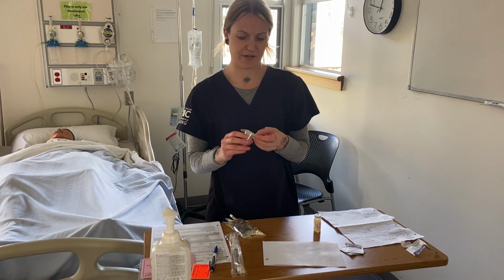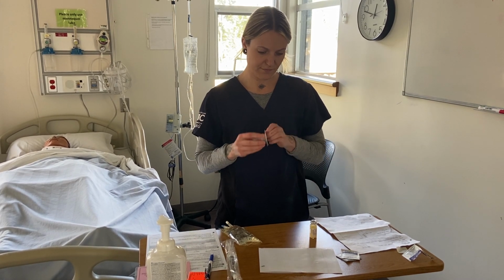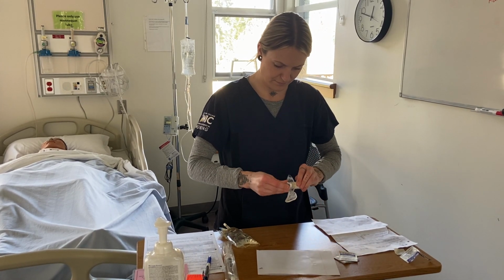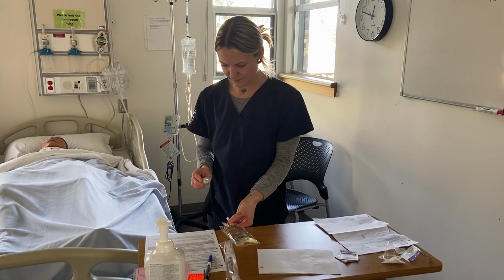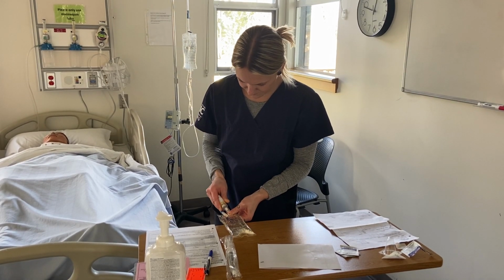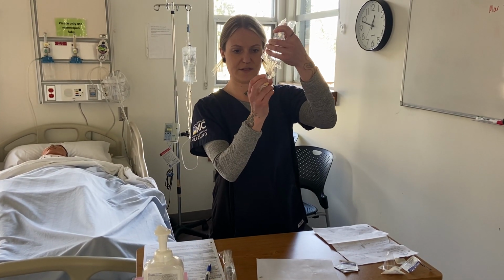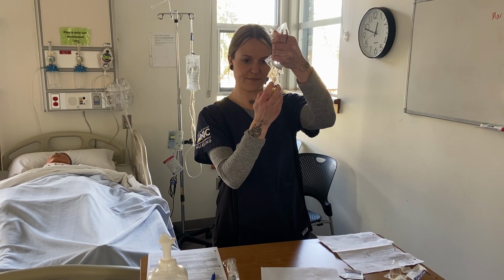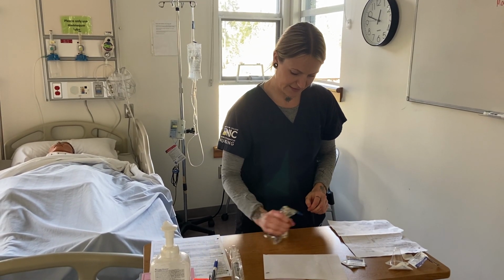And then I will use my reconstitution device. Okay. I'll mix the medication. Just mix it up.